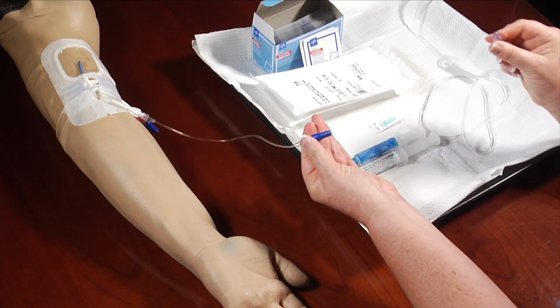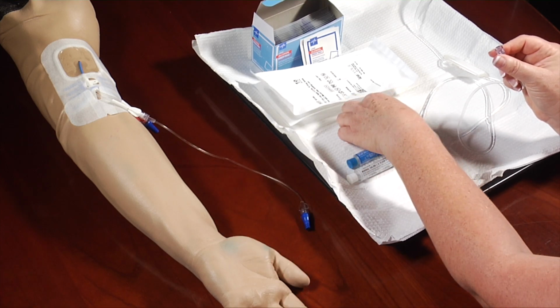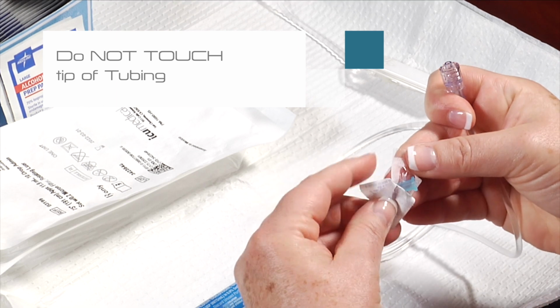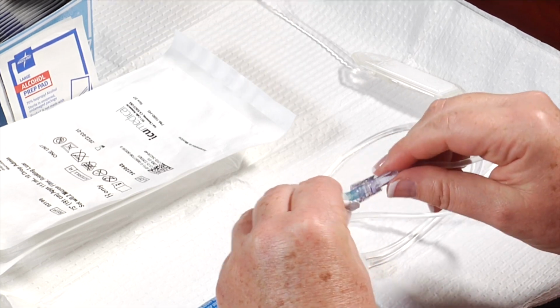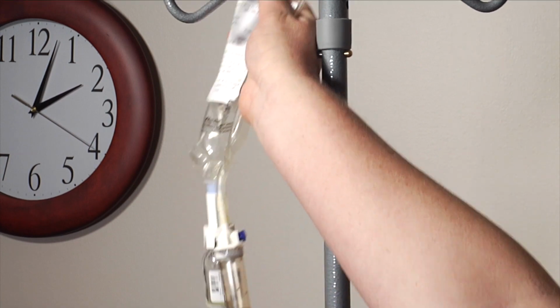If another dose of medication is to be administered the same day, place a light blue sterile cap on the end of the bag using sterile technique. Gravity bag is to be changed daily. You will reuse the bag when administering more than one infusion per day. If bag is not to be reused, discard into an appropriate container.